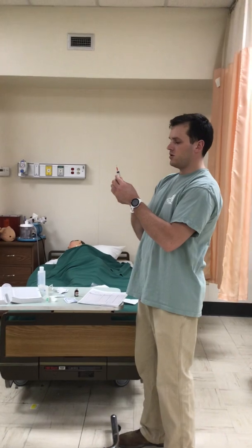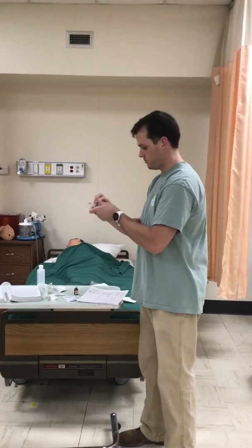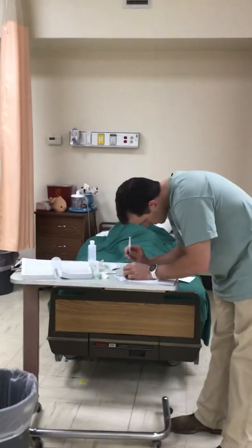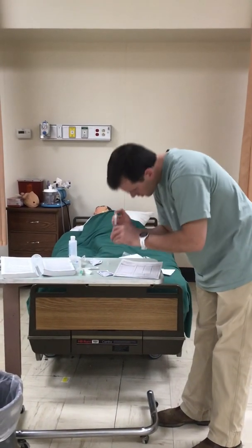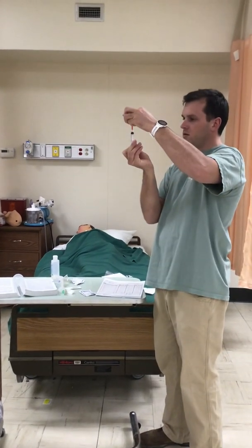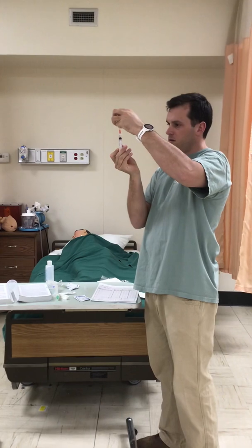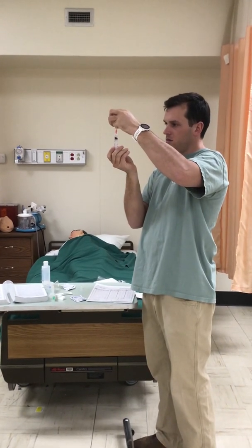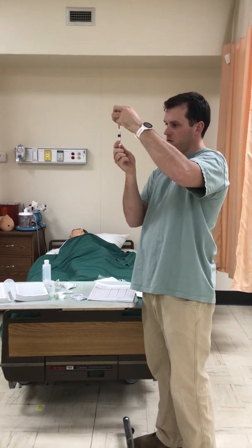I'm going to draw up 3 milliliters of air. Inject 3 milliliters of air and pull back 3 milliliters of furosemide.